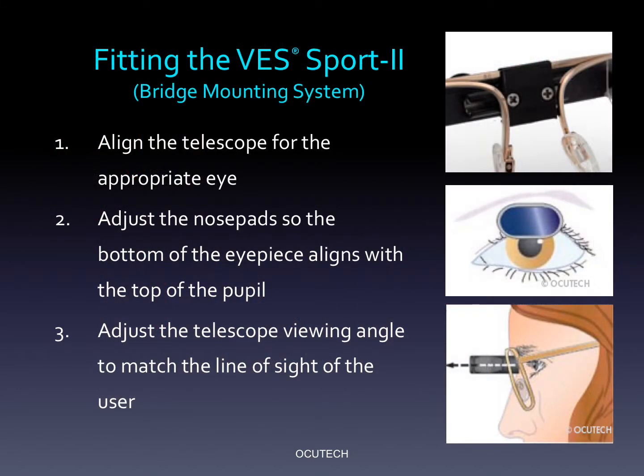There are just three simple steps to positioning the VES Sport 2. In step one, simply loosen the two silver Phillips screws slightly, but not so loose that the telescope won't stay in position. Then simply slide the Sport right or left to align the eyepiece with the center of the patient's pupil. In step two, adjust the eyeglass frame nose pad so that the bottom of the eyepiece aligns with the top of the pupil. In step three, ask the patient to drop their head down slightly and look up into the eyepiece and adjust the telescope viewing angle to match your patient's line of sight. Practice it a few times with a staff member and you'll find just how easy it is to do.